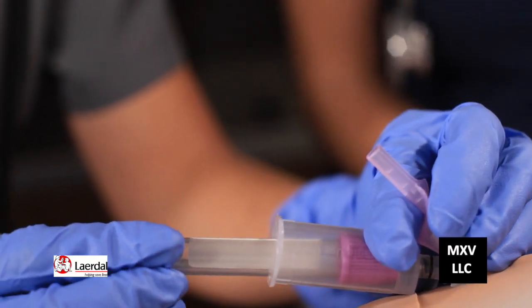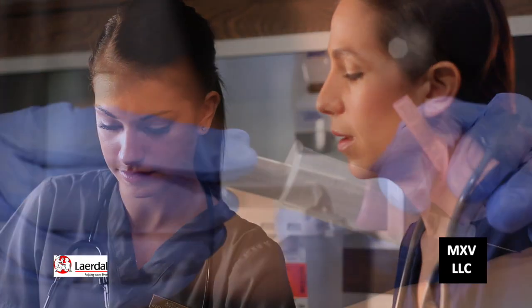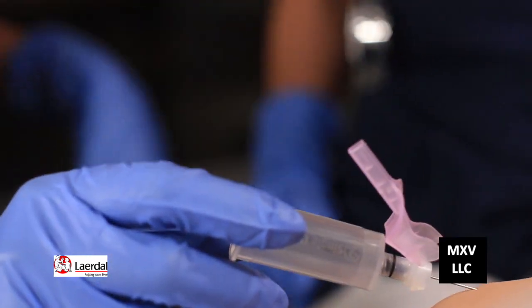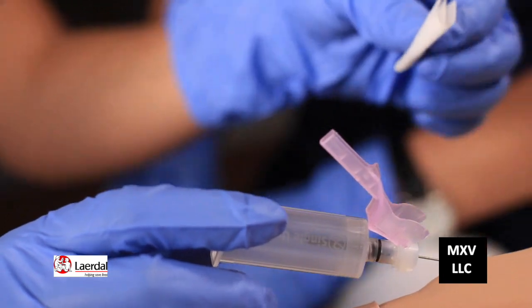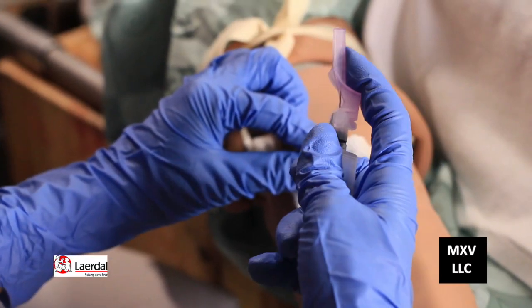Now I'm going to stick the vacutainer on. You got the blood. Take it off. Release the tourniquet. Get your gauze ready, take the gauze and put it on there, then take the needle out and put the safety on the needle.